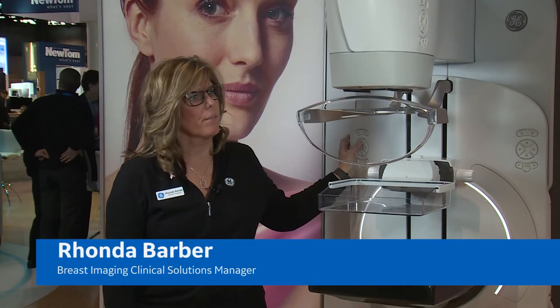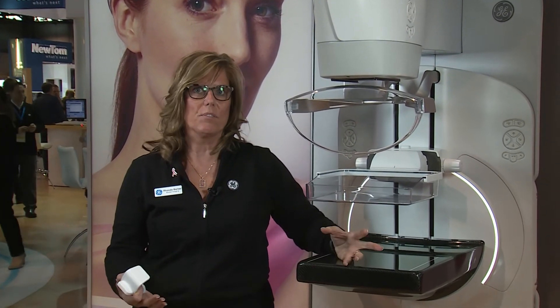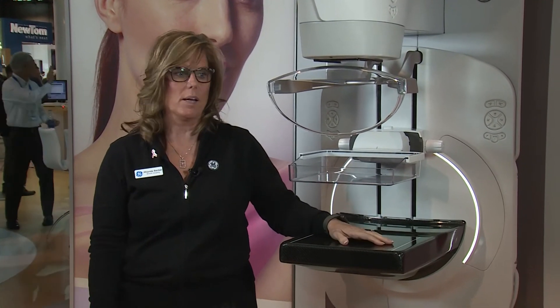Welcome to RSNA 2017. I would like to introduce you to the CineGraph Pristina. CineGraph Pristina was designed by a woman for women, taking into account that patients had specific needs when having a mammogram, as well as the technologist and the radiologist.